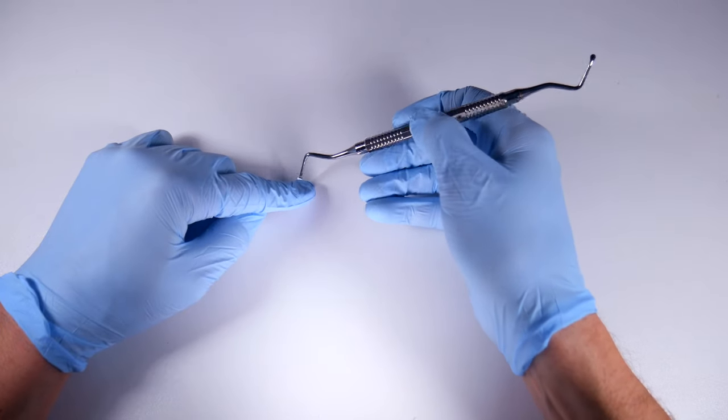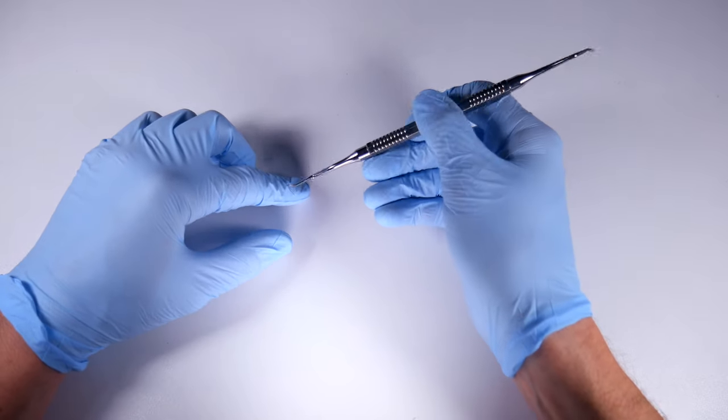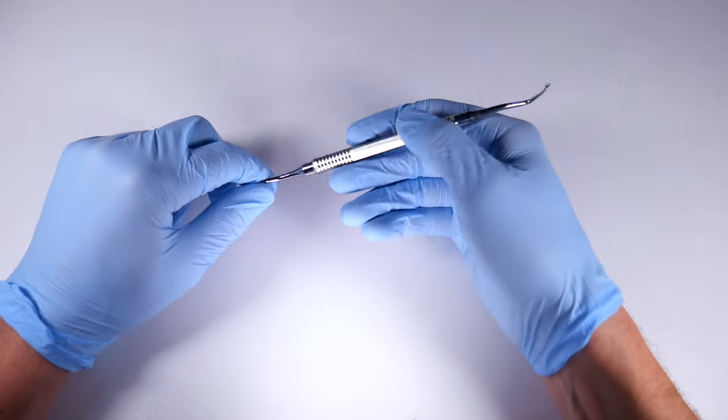Give it a scoop up and you'll find that you're going to be able to peel the tissue off. That follicle is going to peel away a lot easier than with just your traditional sort of flat curette.